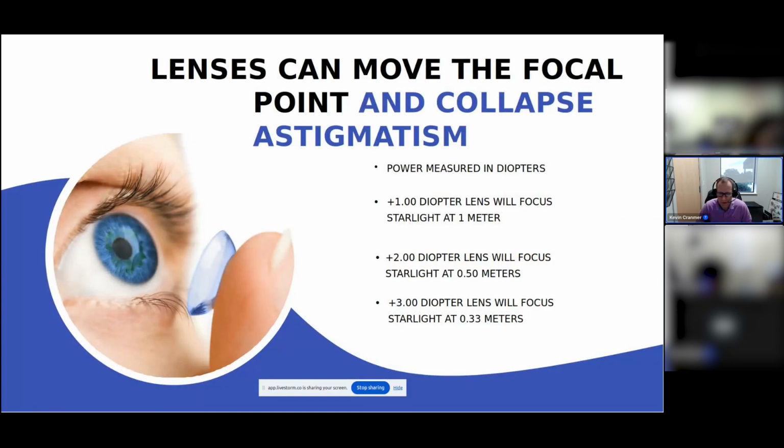So basically, lenses that we use, whether they're contact lenses or glasses, they move the focal point in the eye. And when you refract, it's super important to think of where you're putting that focus point, because if you think about what you're doing with the lenses and putting them in front of the patient with the phoropter, then if you think about where that focal point's going, it'll all make sense.